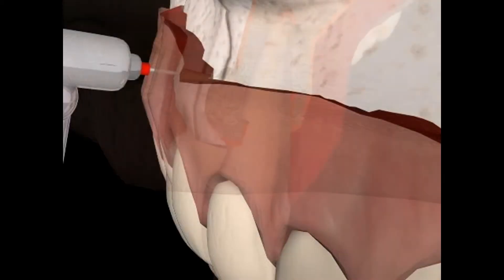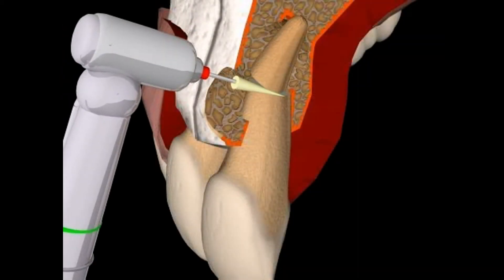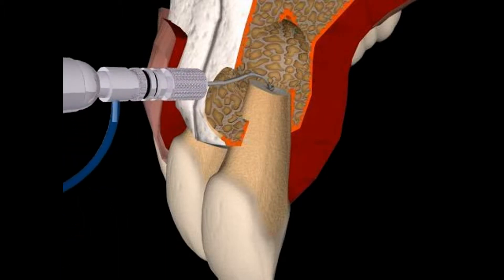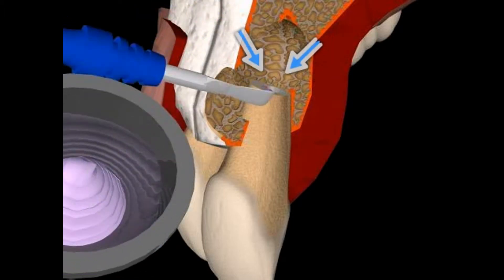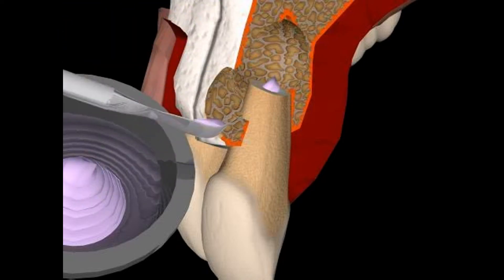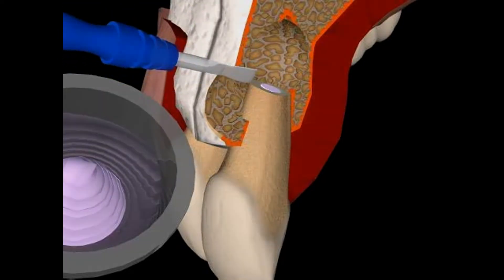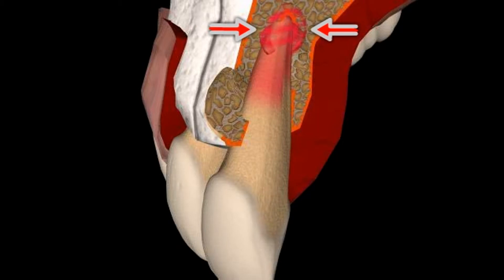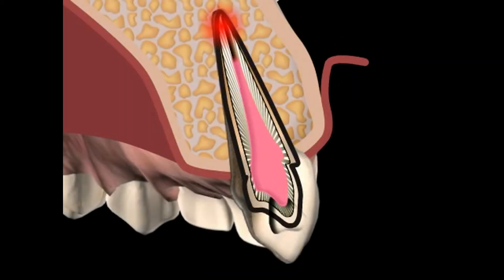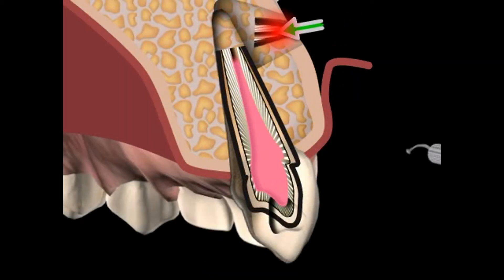Root tip resection with retrograde filling refers to the surgical removal of a root tip and the cleaning of the tooth canal from below. It is also referred to as a retrograde apex seal. A root tip resection is performed on the root tip when a patient is suffering from chronic bone inflammation. You now see a film of a root tip resection with retrograde filling.